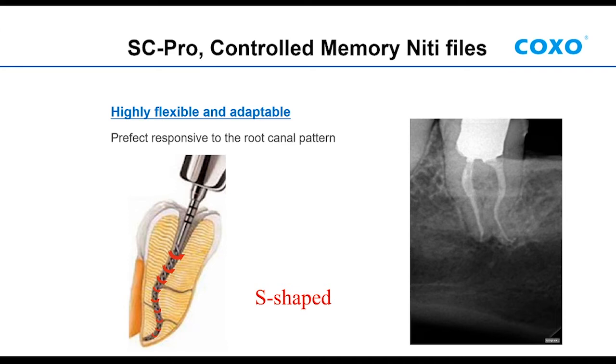And then you can see we use this CM material. This is very highly flexible. It can follow the root canal like an S-shape going inside. Then it will not damage the root canal or make the root canal change to straight. It can follow the original root canal.